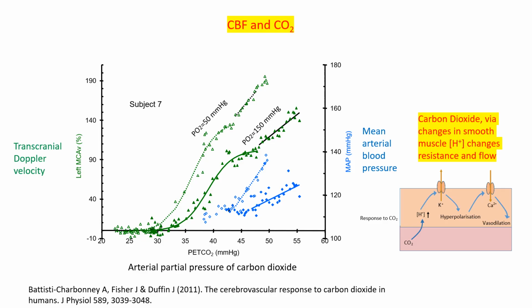Cerebral blood flow changes with blood gases, oxygen, and carbon dioxide. And this graph shows transcranial Doppler, or TCD, measurements of middle cerebral artery blood flow velocity.